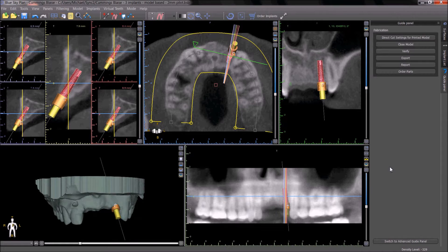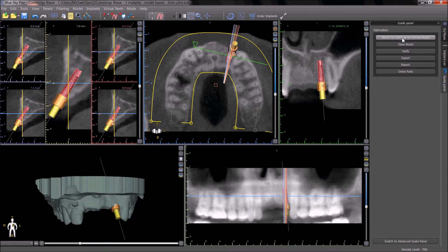If a model-based surgical guide is going to be fabricated for non-Blue Sky Bio direct cut drills, the model-based surgical guide protocol should be modified with the following changes. After pressing the direct cut settings for printed model button in the guide panel, the user should switch over to the implant list.